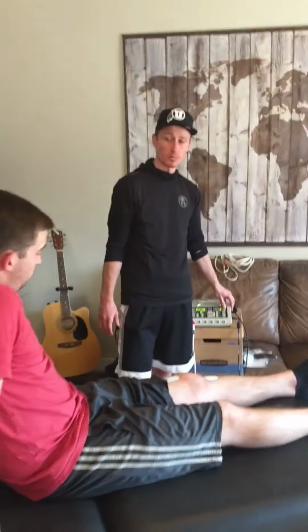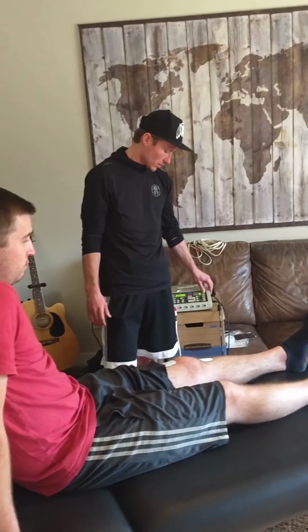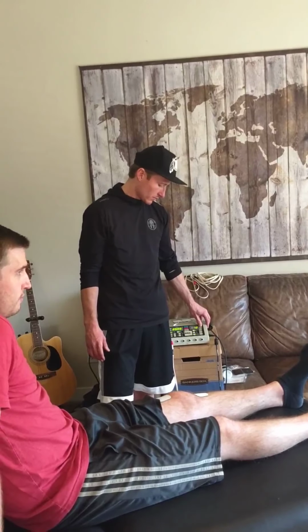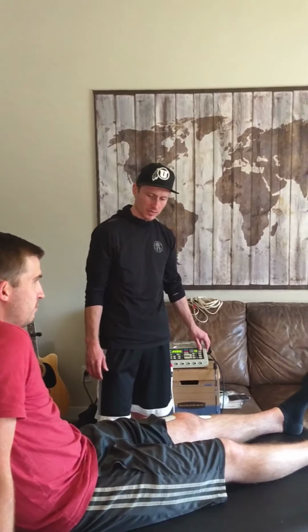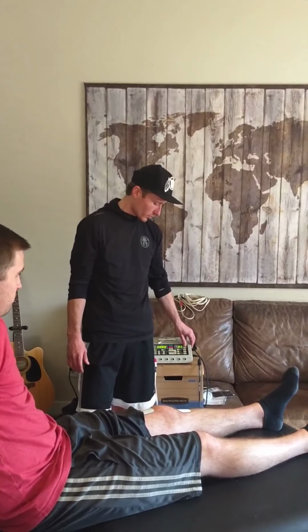Okay. Feel anything yet? Maybe a little bit, but not really. Not quite? No. Okay. Let me know when you start to feel that tingling sensation. Okay. And then we'll just gradually bump it up from there.